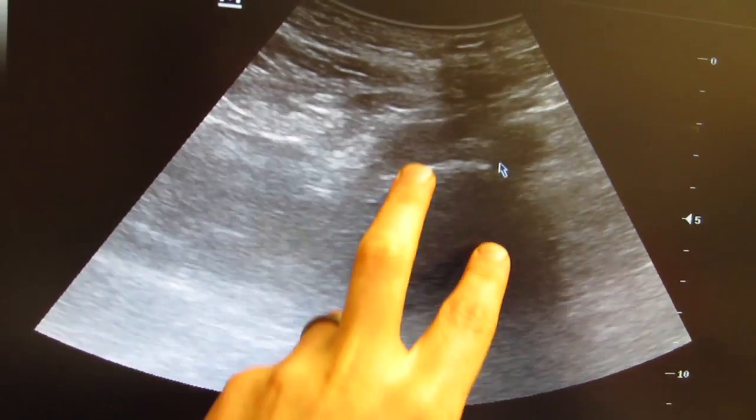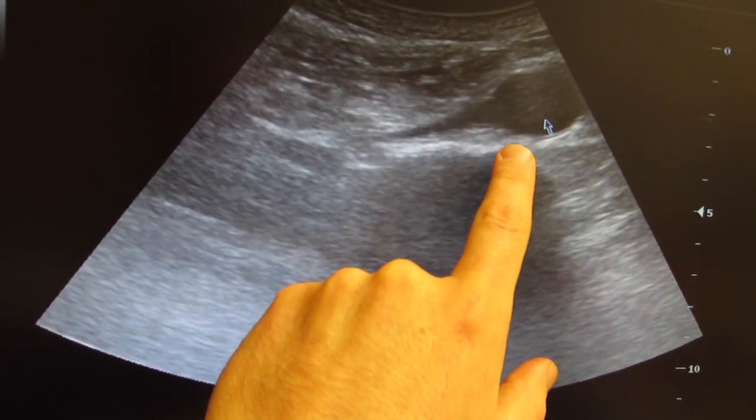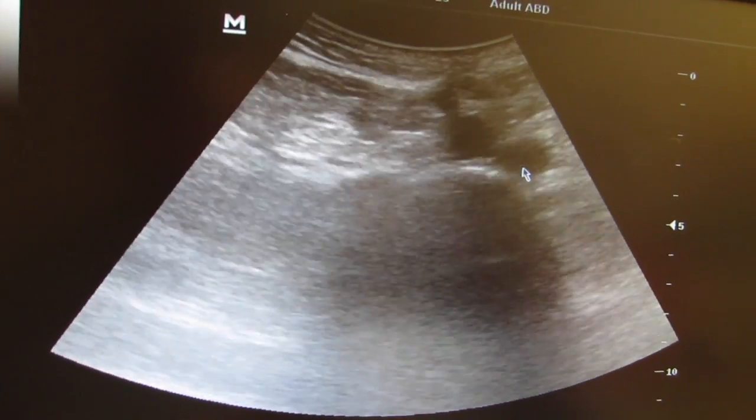As you can see right here, now you're seeing it splitting. We'll bring it back up briefly to show you together, and then it splits, like that. Good. And that's when you know that you've hit the end of your exam.